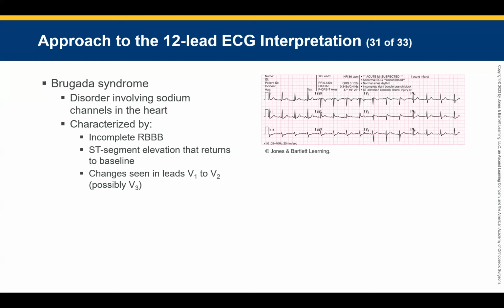So if you've got to have it in 2 leads, can you have elevation in 1 and V5 and that be considered a STEMI, or is it only those pairs on opposite sides? Yeah, I'm going to say no to that. V5 and V6 are a pair. V6 and 1 can overlap. But I would not be looking at AVL and V5 or V5 and 1. It's kind of a different lateral. Yeah, yep.